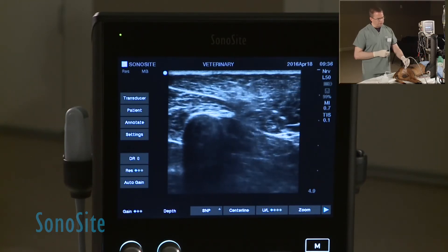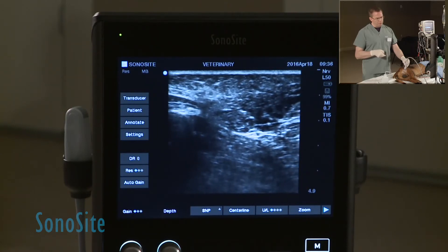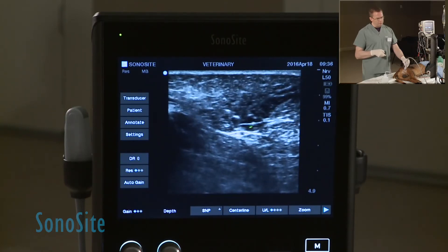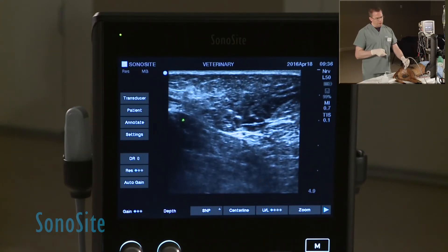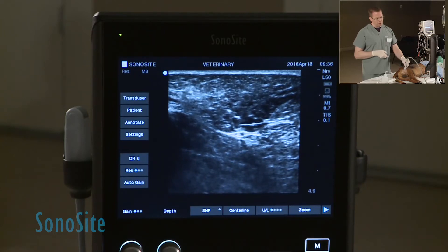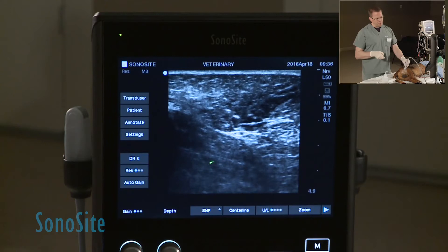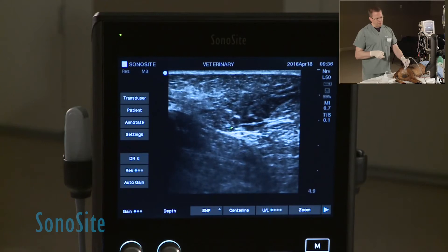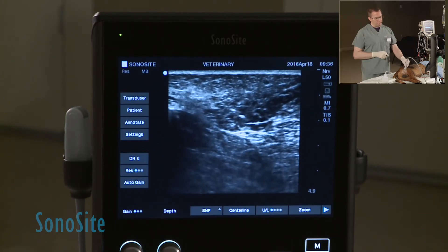As we move the transducer caudally, you can see this is the biceps femoris muscle. It's a rounded triangular shape facing down, and at the deepest part of that biceps femoris is this round structure that almost looks like a pair of eyeglasses — two little round circles, almost like a figure eight, that are hypo- or anechoic structures. That's the sciatic nerve, so that's the target we're looking for.